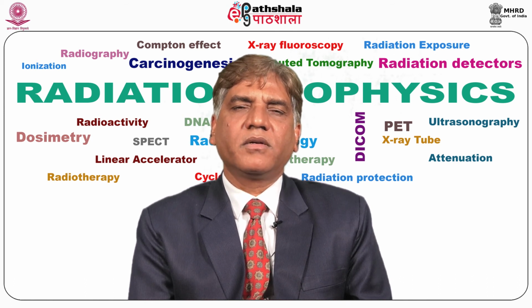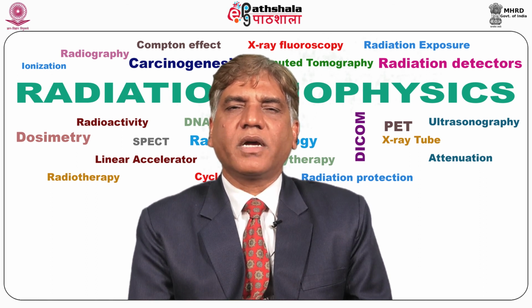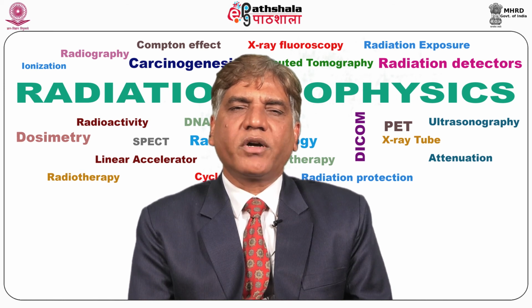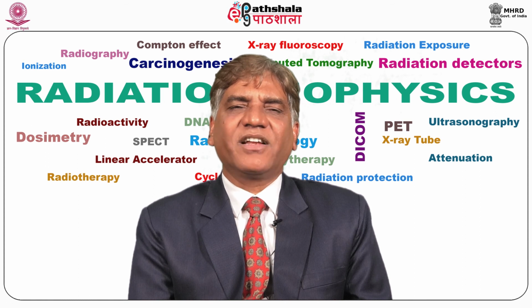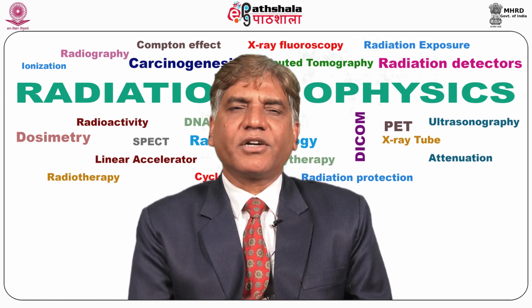Then we need a server. An archiving server is composed of a database server or image manager, short term and long term storage, and a computer that controls the PACS workflow. Third is the display. Finally, to display the digital image, a viewing component is required, referred to as a workstation, and another component of PACS is teleradiology, which is defined as the ability to acquire a diagnostic image at one location and review it at a remote location.